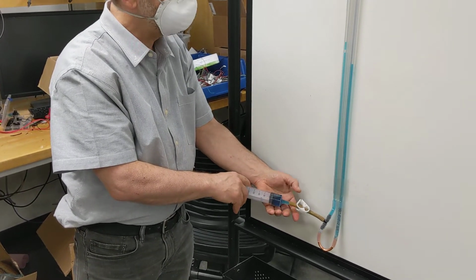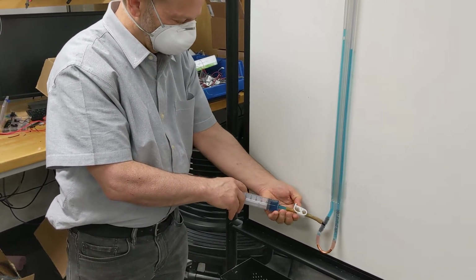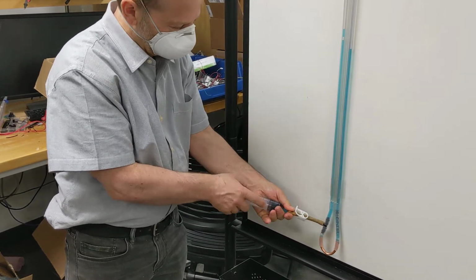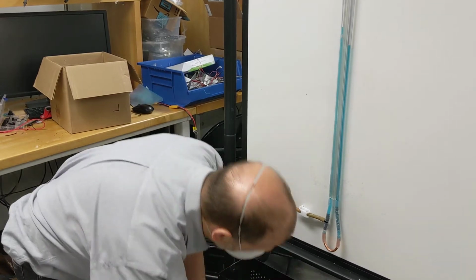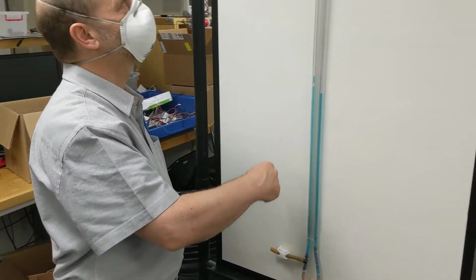That's about right. I'll choke it off right there. That's it. Some bubbles eventually. So a little tour of it.